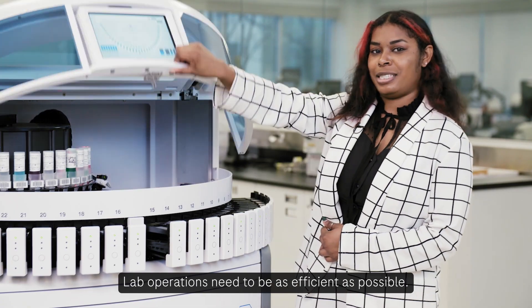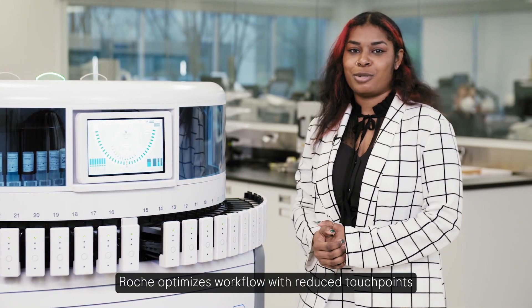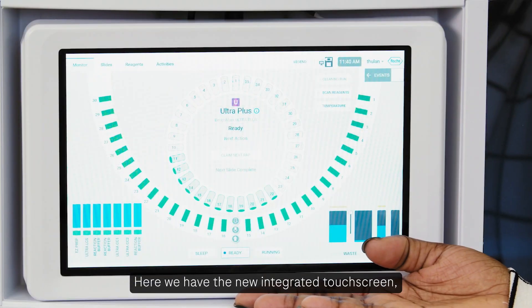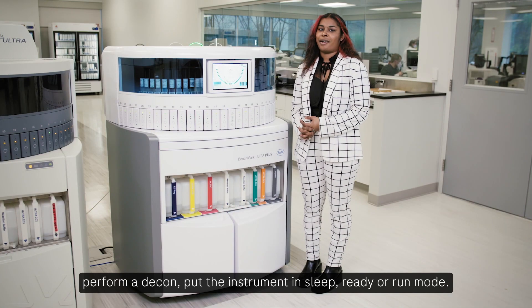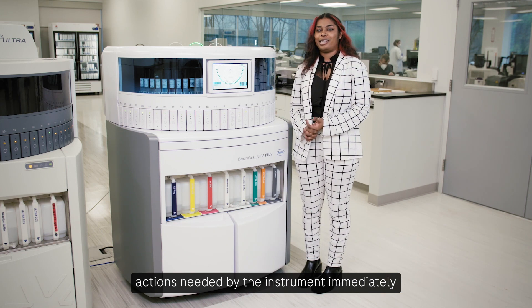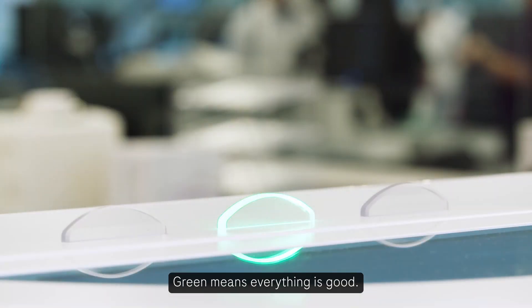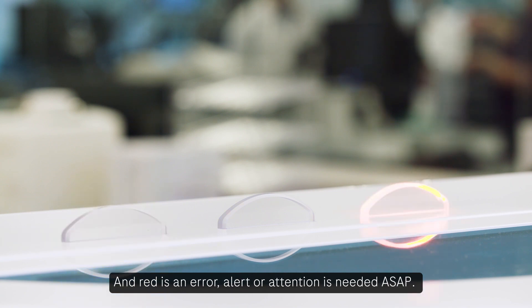Lab operations need to be as efficient as possible. Roche optimizes workflow with reduced touch points and increased integration. Here we have the new integrated touchscreen where we can schedule reagent access points, perform a decon, and put the instrument in sleep, ready, or run mode. The new light indicators help me identify actions needed by the instrument immediately no matter where I am in the lab. Green means everything is good, blue tells me when I have a reagent access point, and red is an error, alert, or attention needed ASAP.